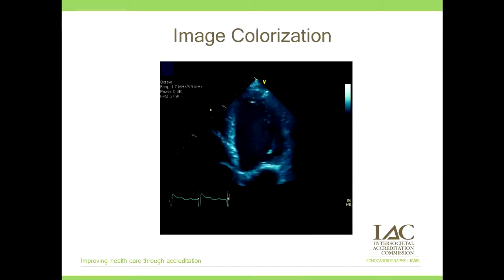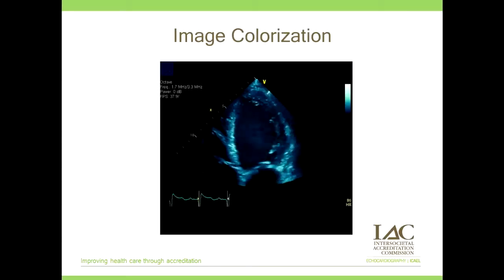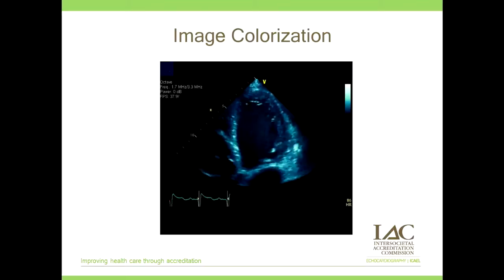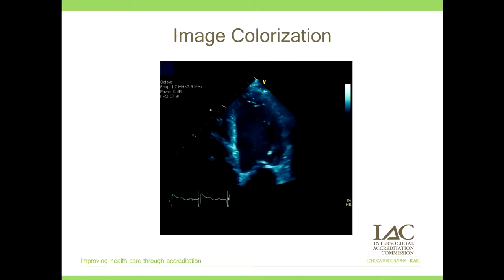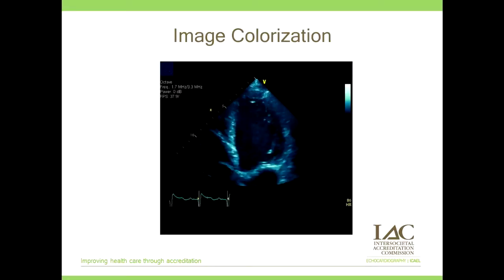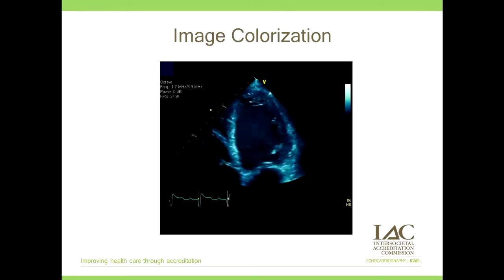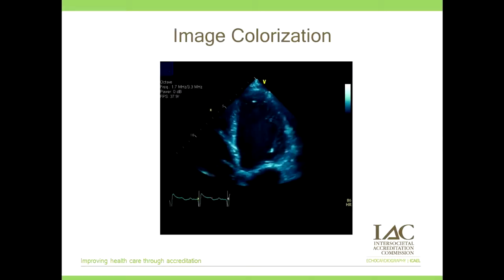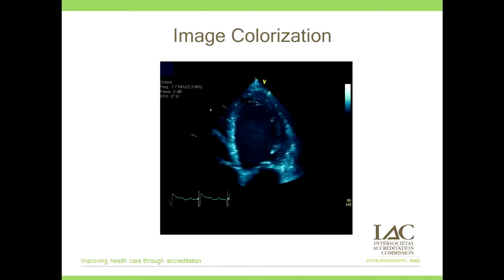Another tool in the ECHO lab is image colorization, which we utilize a lot. As you can see, this patient has rather severe LV dysfunction, and image colorization helps to better see the endocardial definition and the smoke in the left ventricle. This tells the sonographer they need to interrogate the ventricle more thoroughly, looking for a thrombus. Image colorization also helps when the sonographer is tracing the 2D image of the left ventricle for ejection fractions and volumes — an important tool when assessing the left ventricle.